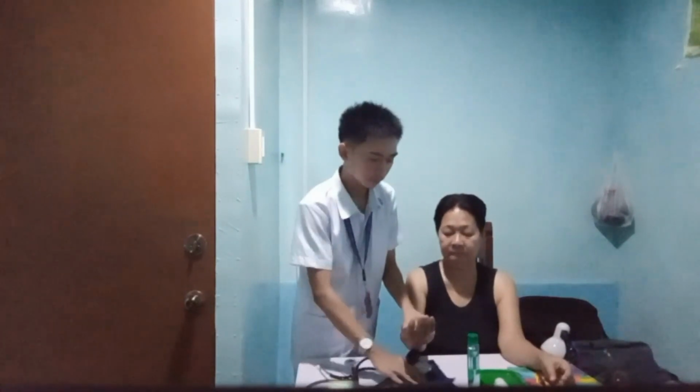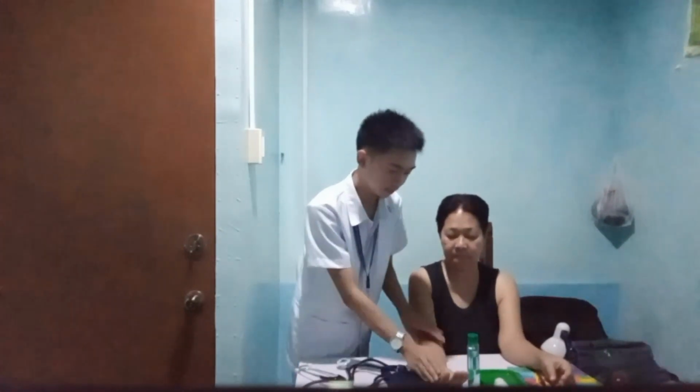None. Okay, thank you. So now position the client appropriately. The client should be sitting unless otherwise specified, and the feet should be on the floor. Slightly flex the arm, with the palm facing up and the arm supported at heart level, and expose the upper arm.